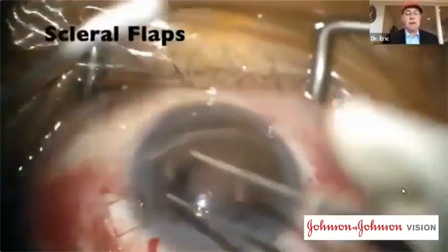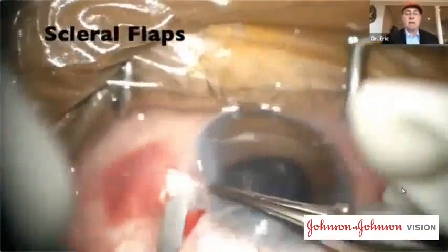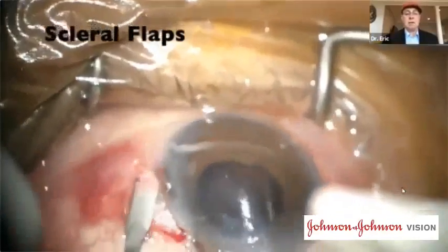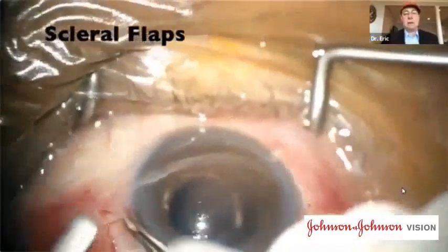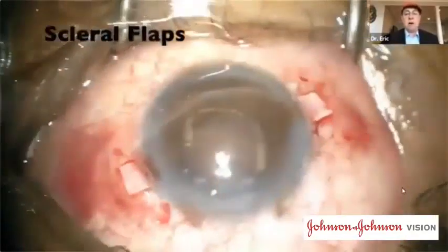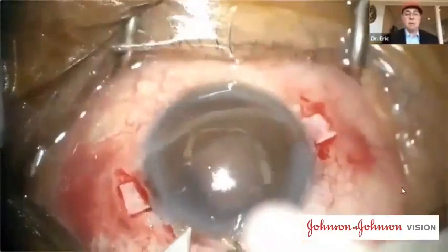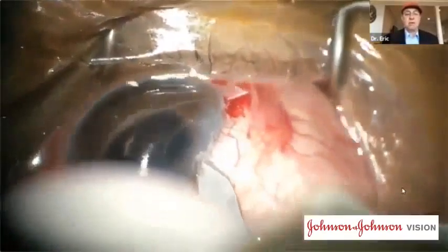We start by making a conjunctival peritomy. We then do a limbus-based scleral flap. We move through the sclera. I like to enter the eye about 2.5 millimeters back. And here you see the scleral flap has been made very nicely. At this time, we go and create the flap on the other side as well. And then I take an MVR blade just to make an infusion port for later on. And then I make my two 2.4 millimeter incisions.